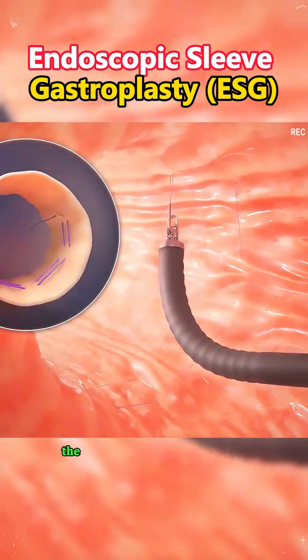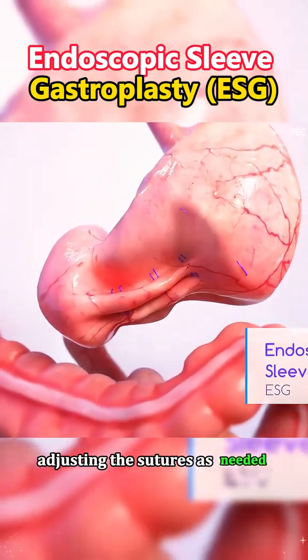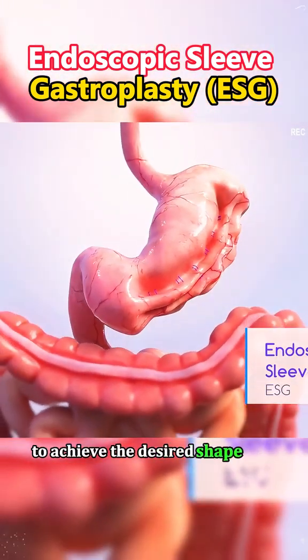Throughout the procedure, the surgeon monitors the stomach and surrounding structures, adjusting the sutures as needed to achieve the desired shape and size.